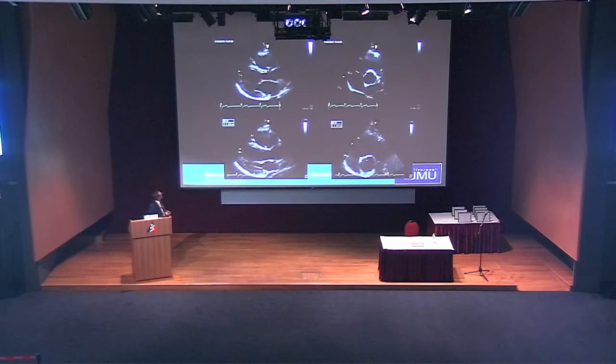Good. So these were the measurements. 40 millimeters here. 40 millimeters slightly offset because the valve was rotated round. This is 40 millimeters. And remember the cutoff 32. So this is still big, but could still be consistent with athletic adaptation. The right ventricle does get big.